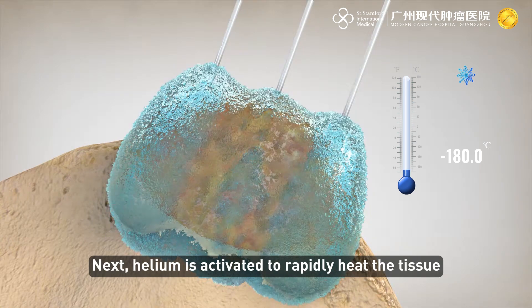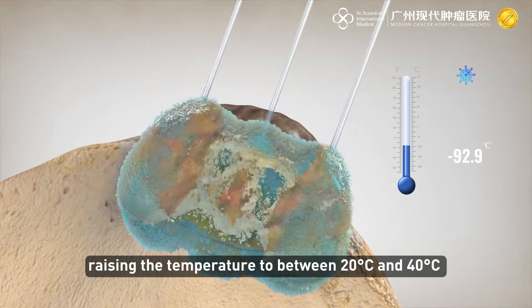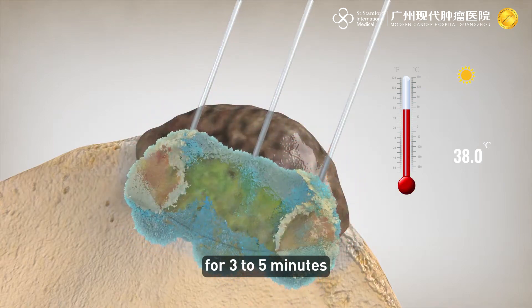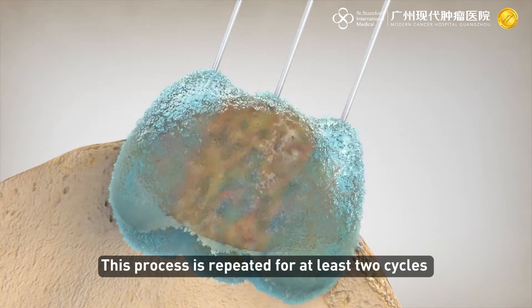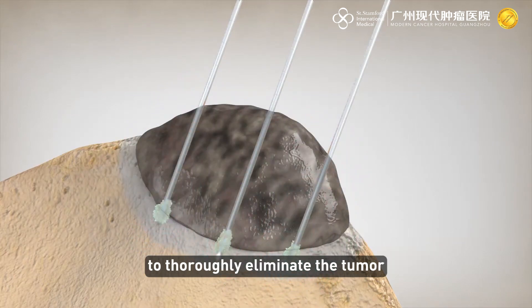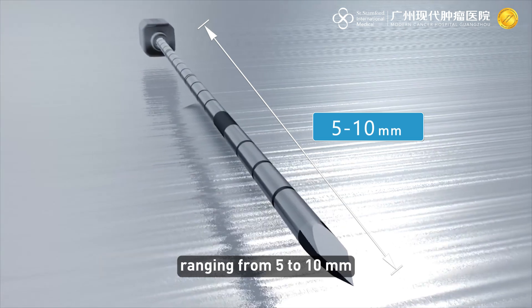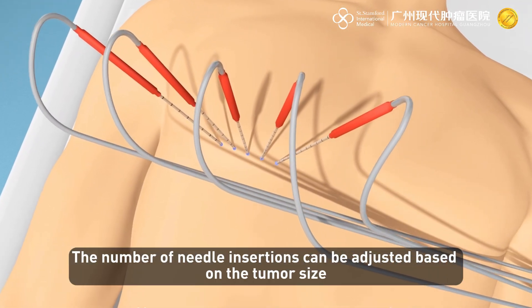After maintaining this temperature for 15 to 20 minutes, the tumor is frozen into an ice ball. The argon is then turned off, and helium is activated to rapidly heat the tissue, raising the temperature to between 20 and 40 degrees Celsius for three to five minutes, causing the ice ball to thaw and rupture. This process is repeated for at least two cycles to thoroughly eliminate the tumor.